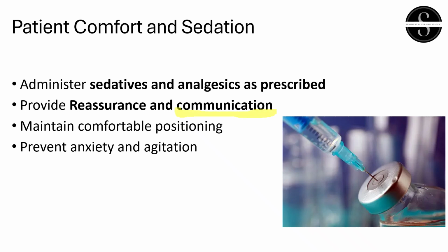Though the patient is on a ventilator under sedation, we have to go and talk to the patient. Whatever procedure we do, for example if you are going to do suctioning or ABG sampling, we have to definitely talk to the patient. Madam, we are going to do some suctioning so that we will remove the secretions from your lungs. I am going to take the blood sample so that the blood reports are okay. We will slowly be weaning you off from the ventilator. Each and every aspect we have to communicate to the patient, whether the patient is on sedation or not. Never mind that.